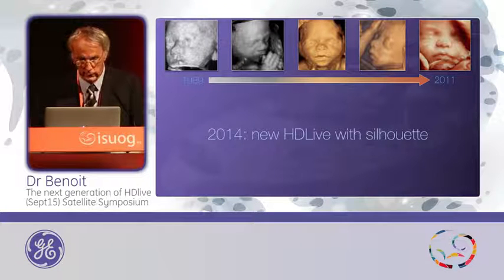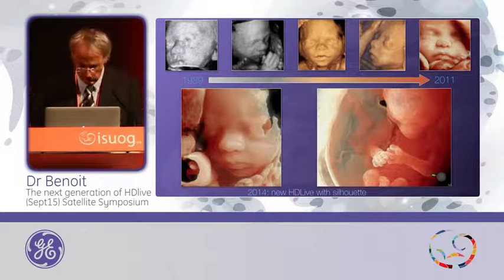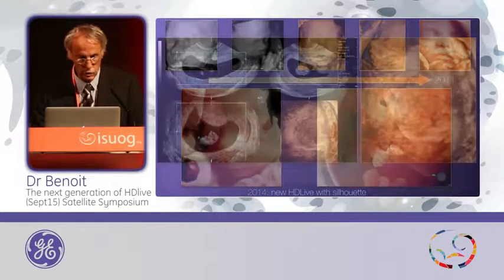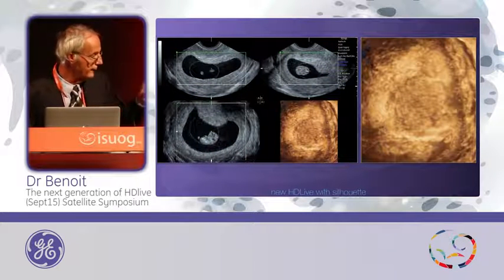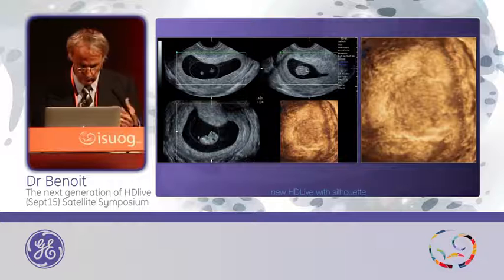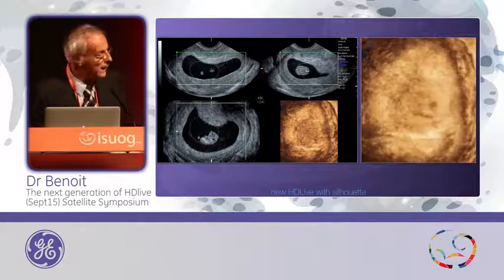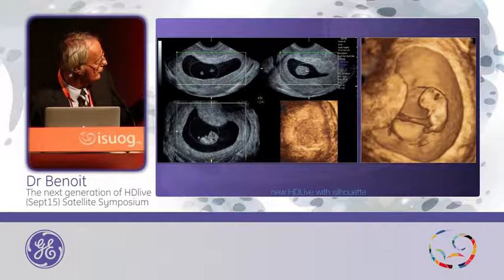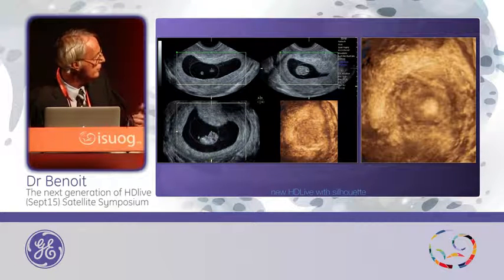What is this new HDLive with silhouette? It is this — you can obtain this kind of rendering. I will show you how to use it first on an early pregnancy with a gestational sac. This is a gestational sac with the embryo inside. You put a box around the gestational sac. When you move inside, this is classic surface rendering. It's quite difficult — sometimes you have to use a magic cut.